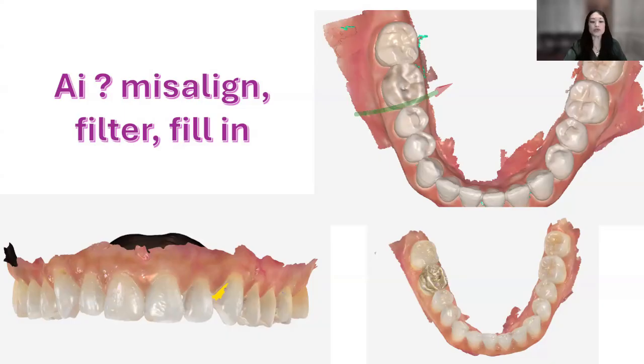So if you go to the lower and you see this little bit of yellow, you won't see that in your final scan, but what the yellow indicates after post-processing is that this area, although we have great data everywhere else, this one area that's yellow is just so that our eyes can pick it up and see that we missed some data there. But the data wasn't the size that the software can fill in with the AI. We will make a clinical call on whether we need to fill that in or we're okay with AI. So that's when my verbiage is first set of eyes, but second opinion to you.